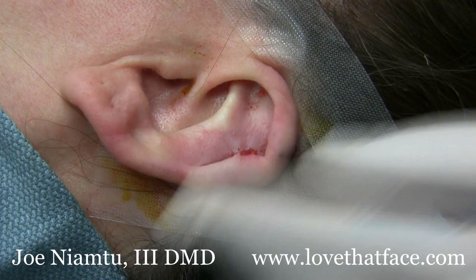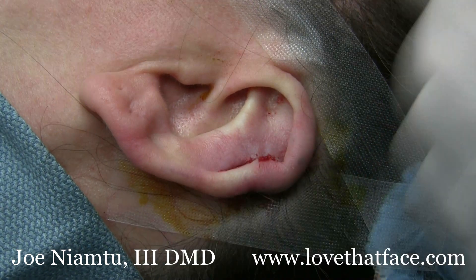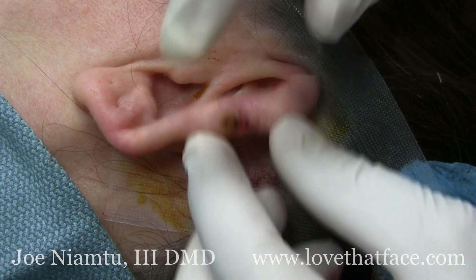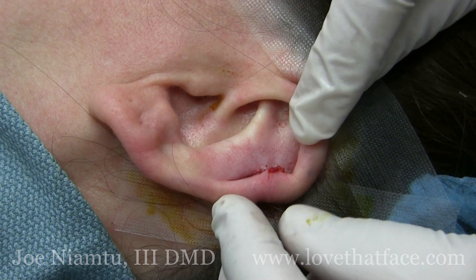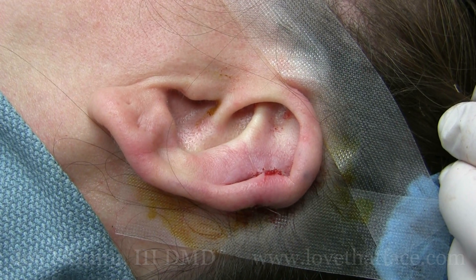There is our keloid removal with the Elman Cortex laser. We used the cutting handpiece at seven watts to remove it, and then used the fractional laser at the high setting to treat the base of the keloid. I'm Dr. Joe and I am too — lovethatface.com. Thank you.